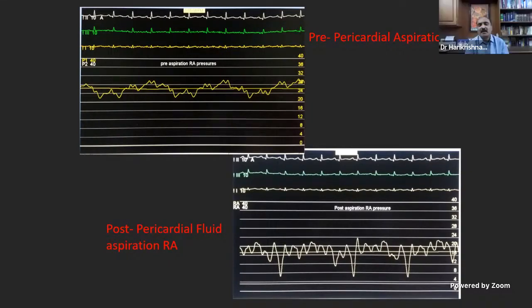Okay, so pre-pericardial aspiration, RA, and subsequently, post-pericardial aspiration, RA. These are the two tracings. Can you tell us what is happening? This particular hemodynamic process is shown. Pre-pericardial aspiration in the upper chart, sir. There is a prominent Y descent. In the upper tracing, there is no prominent descent, no?